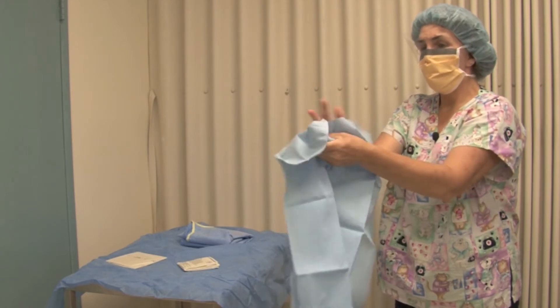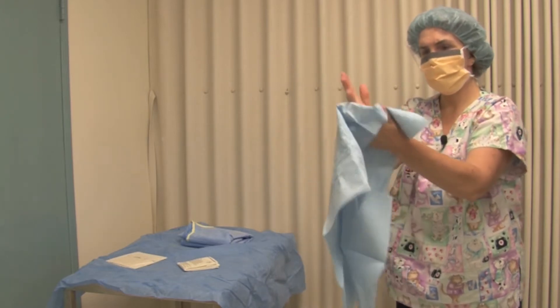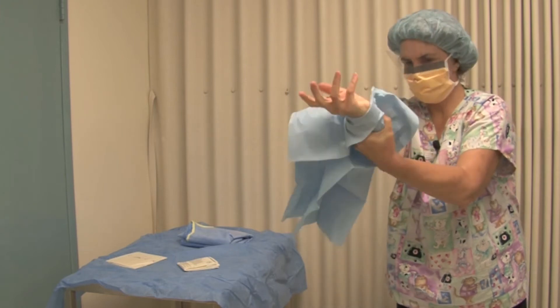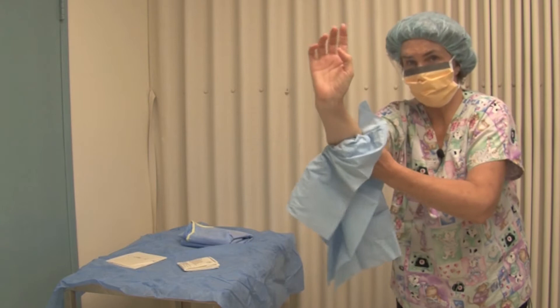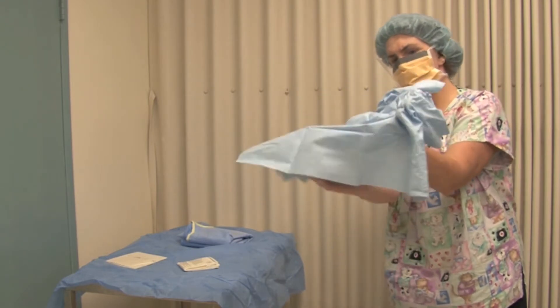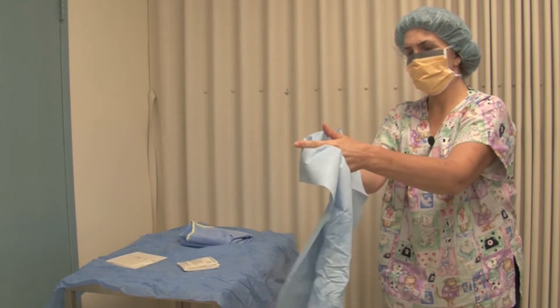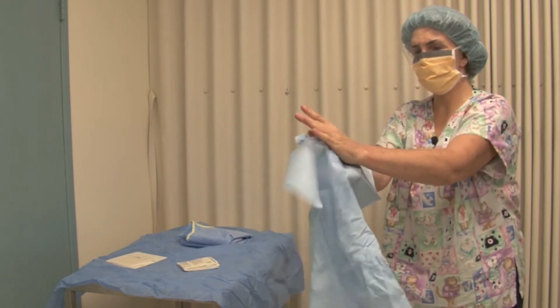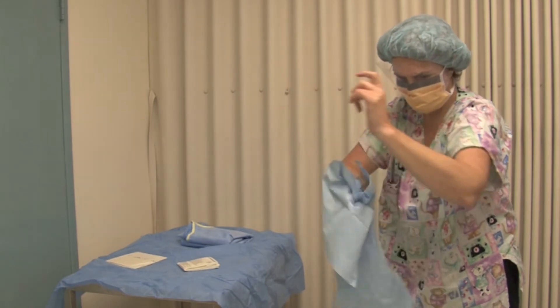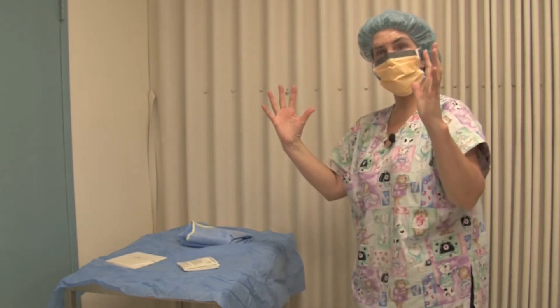It's just a process of using half of the towel — so you'll see that I'm only drying this right hand with the top left-hand side of the towel. I'm careful that the piece flapping around the bottom doesn't hit me, so you can see I've leaned slightly forward. I'm happy that hand is dry. I then switch ends of my towel, going to the right-hand end to dry my left hand — dry each individual finger, make sure you dry the webbing in between your fingers. Lean forward so that piece doesn't touch the front, and I hand that off to my Scout nurse who's just behind me out of shot.